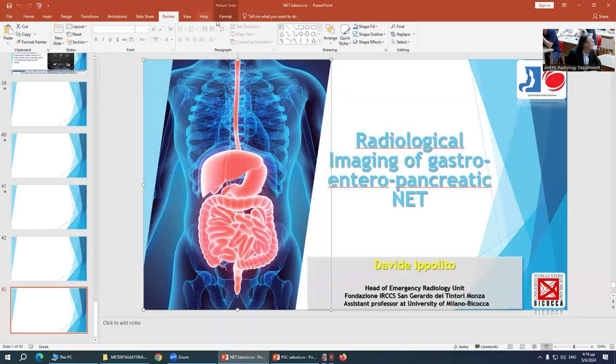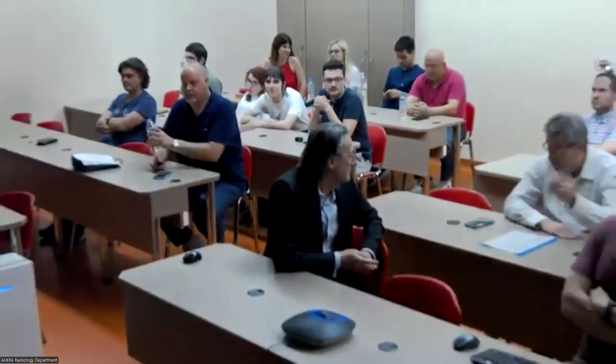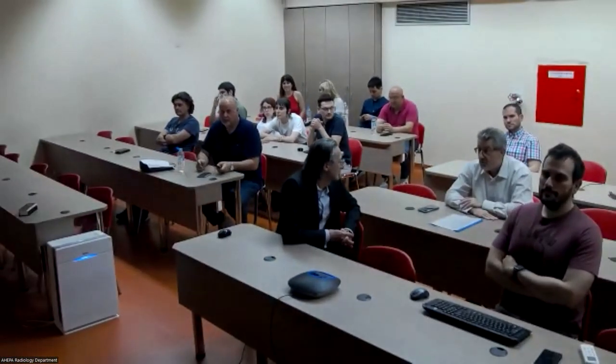Very comprehensive overview, a spectacular talk actually, and a very comprehensive overview of neuroendocrine tumors. They are discovered with increasing frequency in the last decade, at least in the last two decades. So you have mentioned everything, but allow me to point out something that should be remembered. Although it seems easy to diagnose because of the arterial enhancement, because of the calcification or the hemorrhage, they present very, very different forms of tumors.